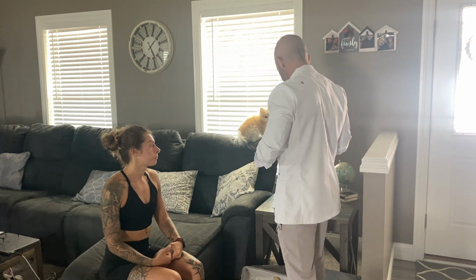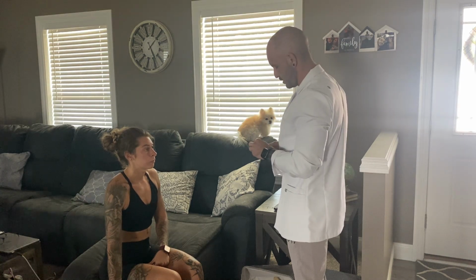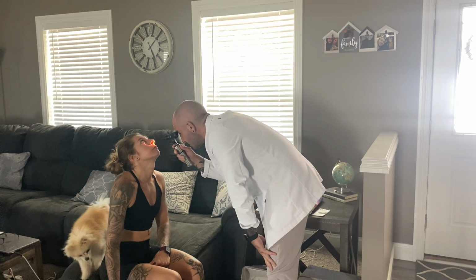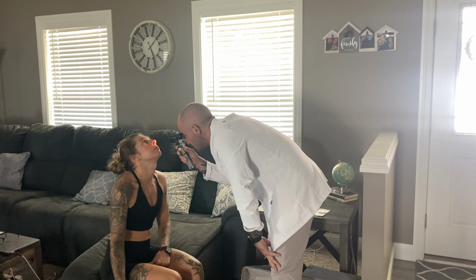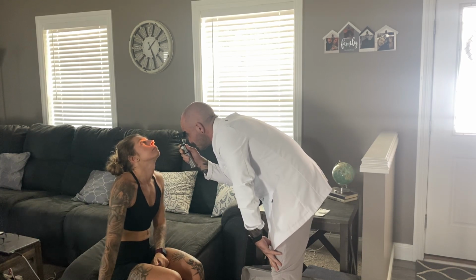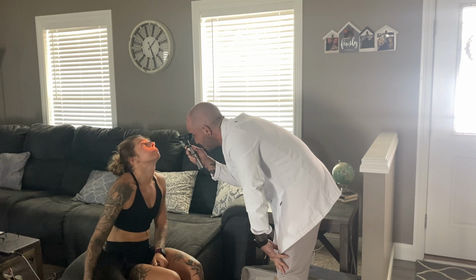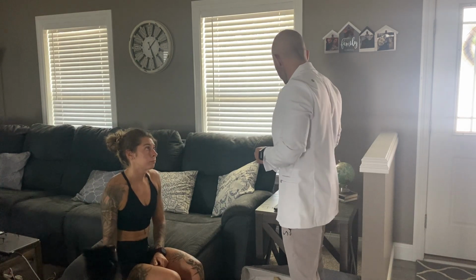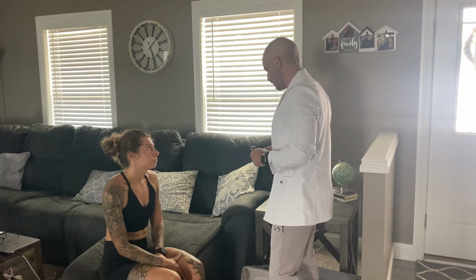Next we're going to use the otoscope, and we're going to inspect your nares. So just looking at hair distribution, looking at the mucosa, checking the turbinates, and then looking at the septum, making sure there's no lesions or septal deviation. She does have a septum piercing here. And then same bilaterally there. All the structures in there appear normal. The mucosa was a nice red color. I didn't see any drainage. Like I said, there were no polyps or nodules noted.